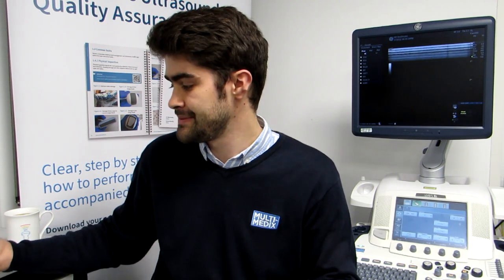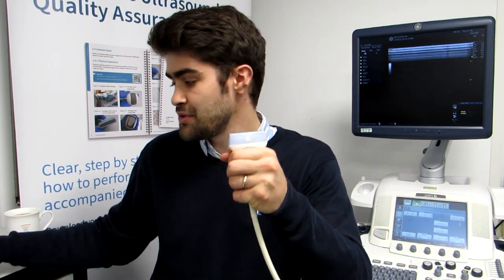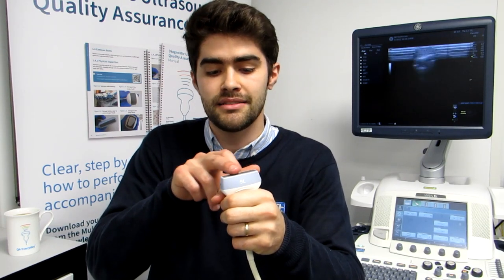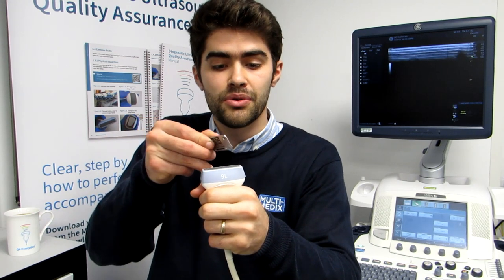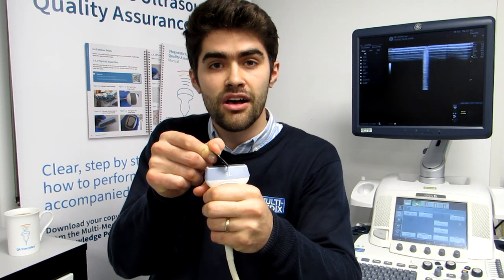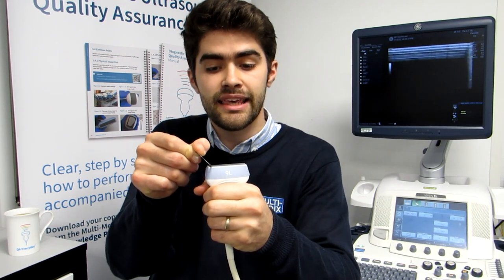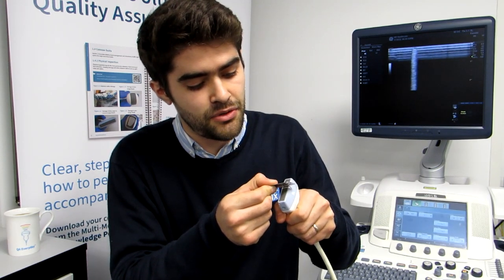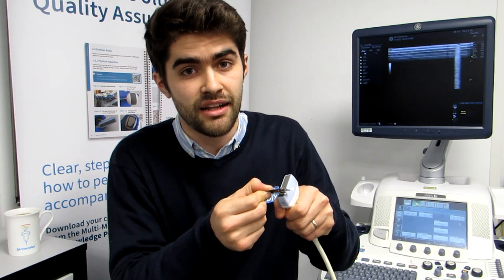Now that you've adjusted your settings I'm going to show you the technique of using the Multimedics QA test tool. The first thing you're going to need to do is apply a thin film of water over the top of your lens. Then you're going to take your test tool and hold it at 45 degrees to the lens and move it smoothly over the lens face, taking care not to apply too much pressure.